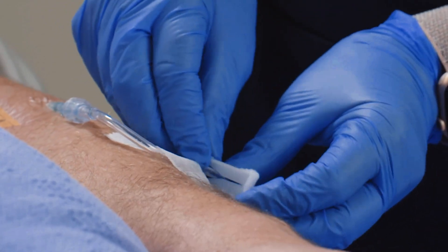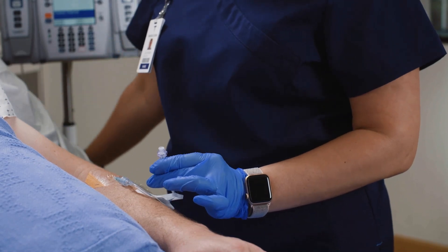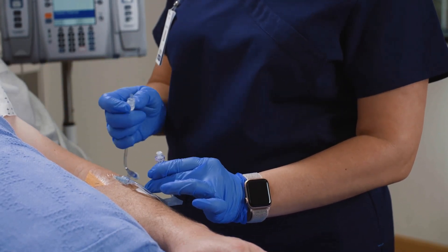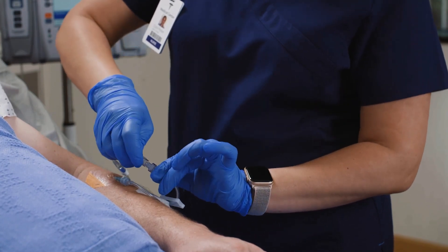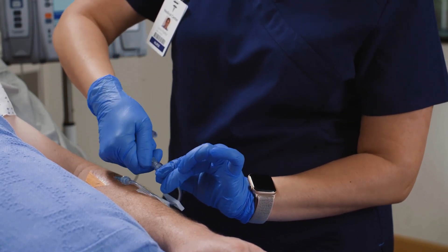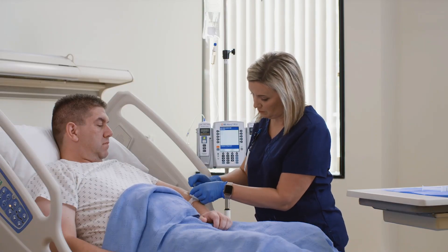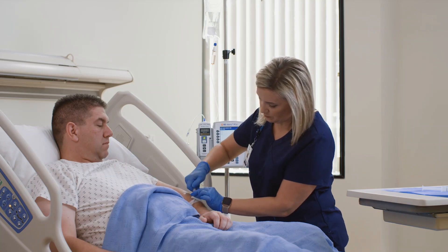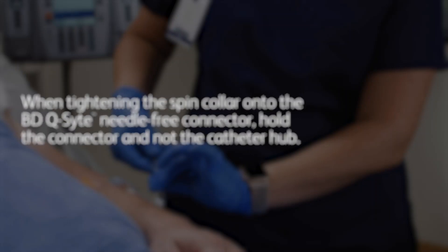Unclamp the catheter or extension set prior to accessing the connector. If the mating lure is a two-piece spin collar, pull back the collar, insert the lure with a straight-in motion, and rotate a one-quarter turn clockwise before tightening the spin collar. When tightening the spin collar onto the BD Q-Site needle-free connector, hold the connector and not the catheter hub. This will help avoid inadvertent overtightening to the catheter hub, which could result in difficulty when removing the BD Q-Site connector from the hub.